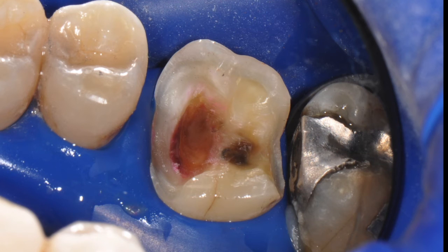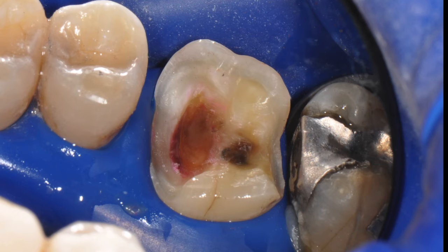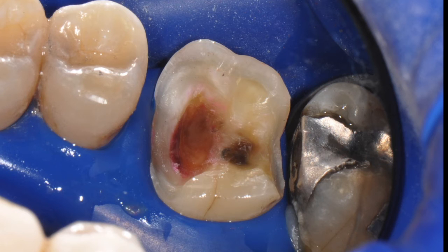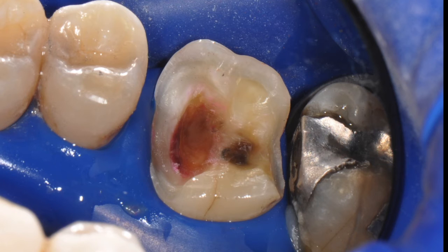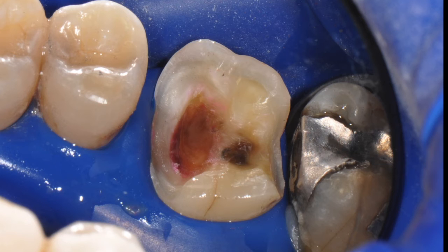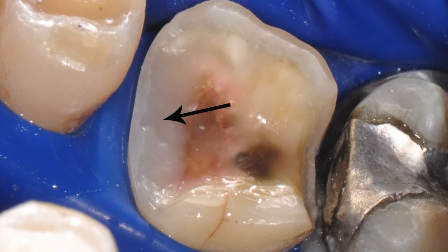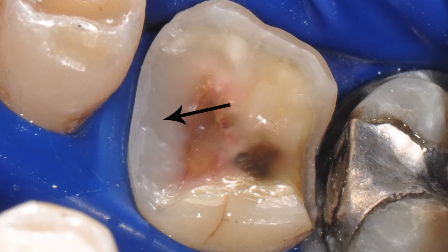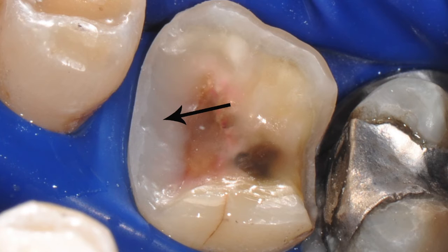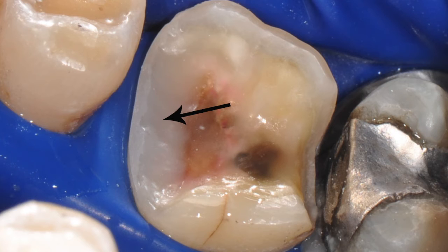Following caries removal, the outline prep is completed and smoothed. This tooth required full occlusal coverage and bevels were placed on enamel margins to enhance bonding surface area. Air abrasion was also performed to enhance bondability to the dentin. Because the mesial decay went sub-gingival, we decided to elevate the margin of our preparation above the gum line by performing a gingival margin elevation technique as taught by Pascal Manier.